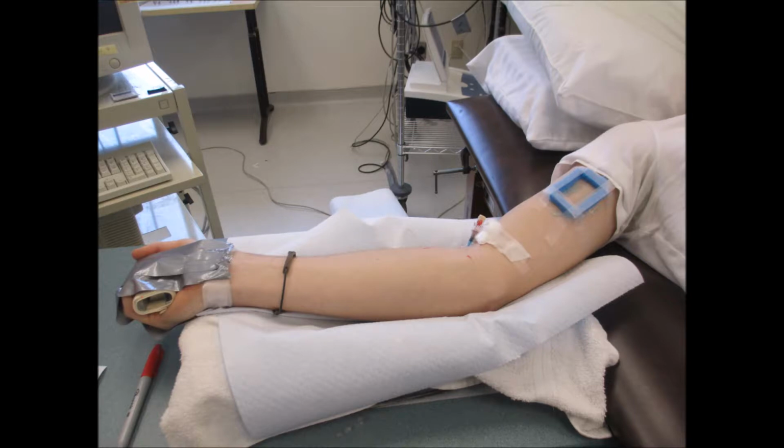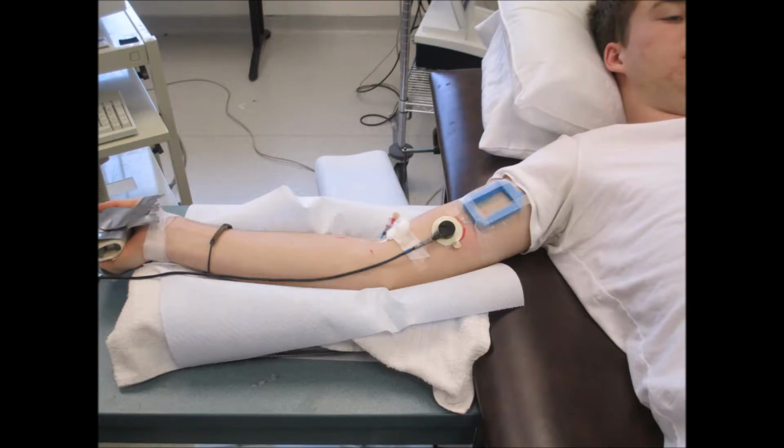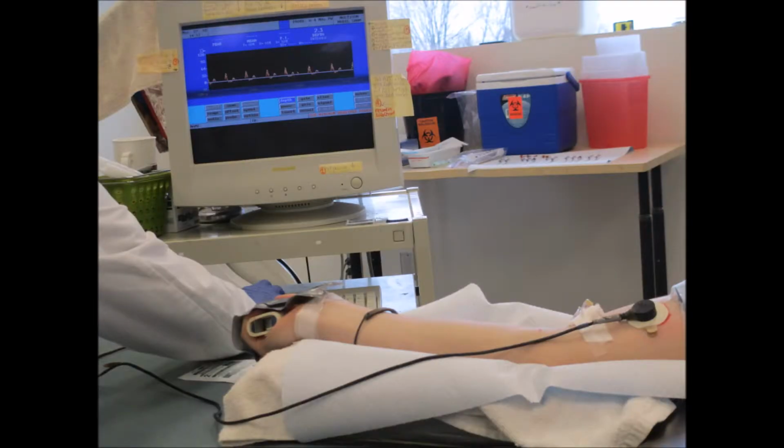This is done by placing a flat probe to the skin over the brachial artery, while the transducer emits a high-frequency sound wave. These sound waves are then reflected back to the probe, which enables the user to graphically visualize the velocity of blood flow.